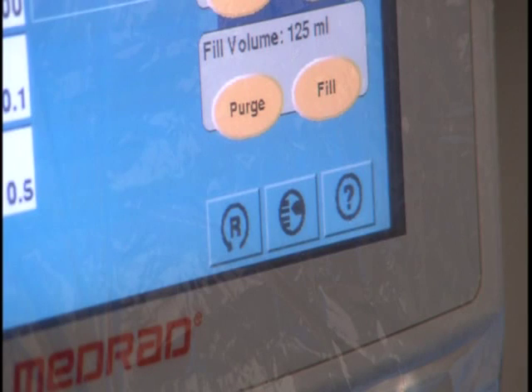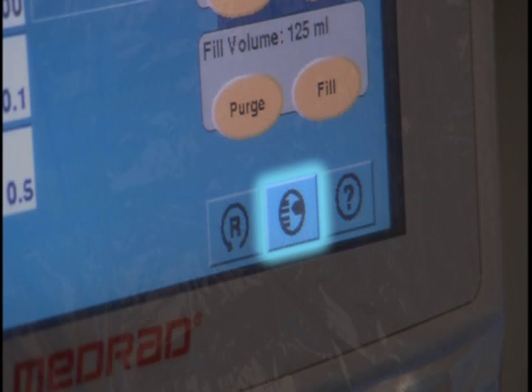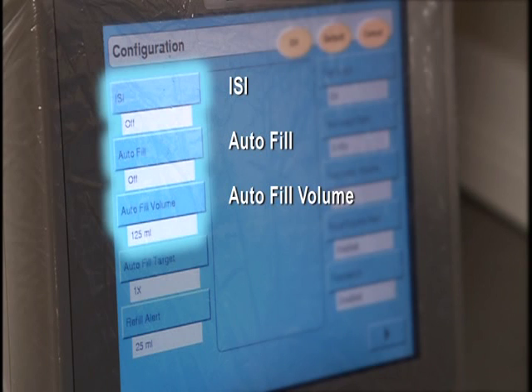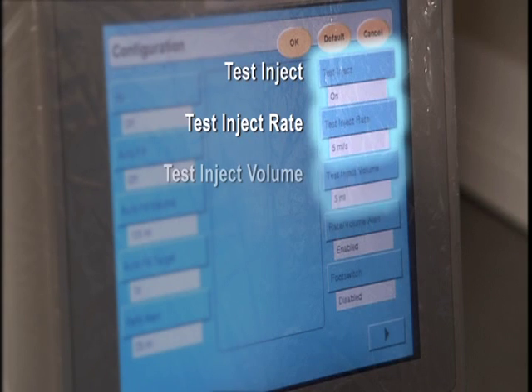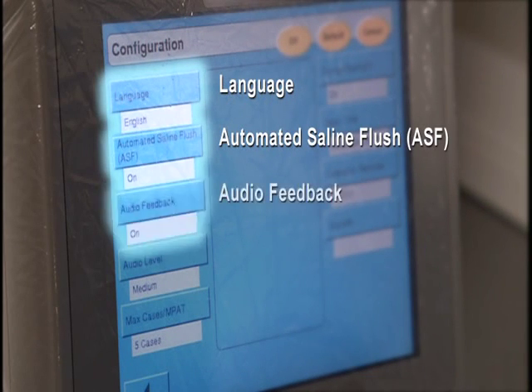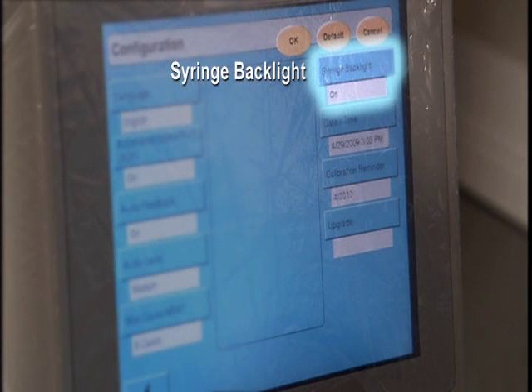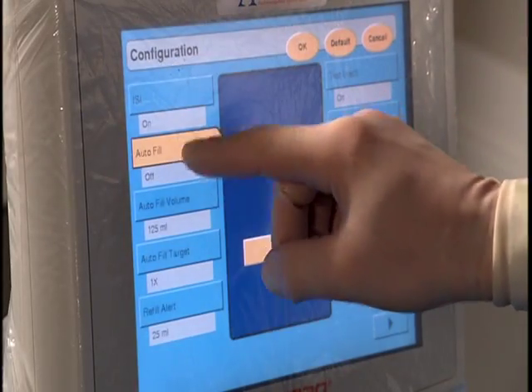Additional features of the DCU include Configuration, Help, and Reset. The configuration icon allows the selection of configurable options and preferences. These include ISI, Autofill, Autofill Volume, Autofill Target, Refill Alert, Test Inject Rate, Test Inject Volume, Rate Volume Alert, Foot Switch, Language, Automated Saline Flush, or ASF, Audio Feedback, Audio Level, Max Cases per MPAT, Syringe Backlight, Date, Time, and Calibration Reminder. Touch the appropriate button for more information.